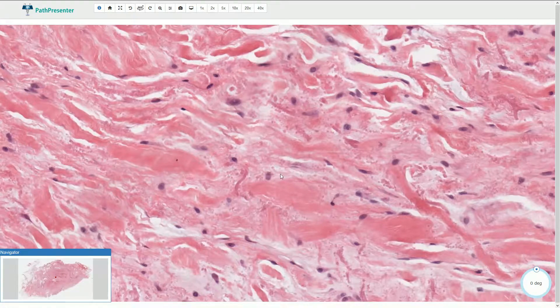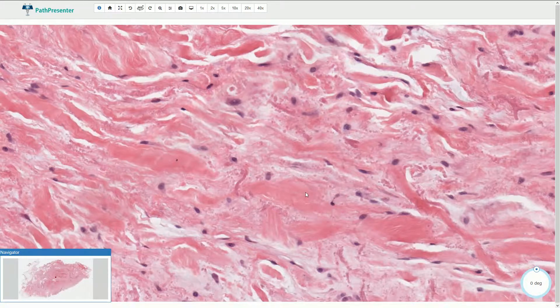Elastofibroma is a benign fibrous tumor containing abnormal elastic fibers within collagenous stroma, and it could be admixed with variable components of mature adipose tissue. The tumor usually affects women older than 50 years of age, and the most common localization is the inferior margin of the scapula. It is a soft tissue tumor found in the subcutaneous tissue in this area.